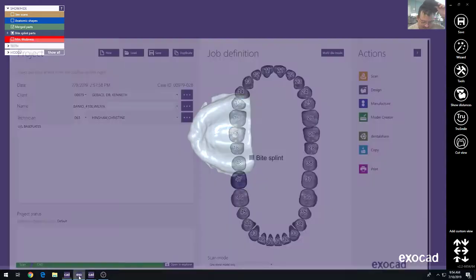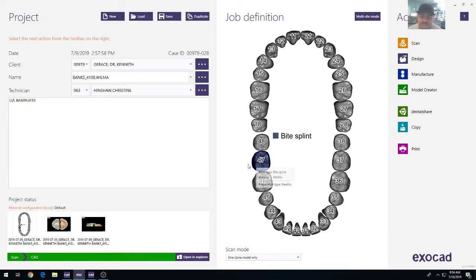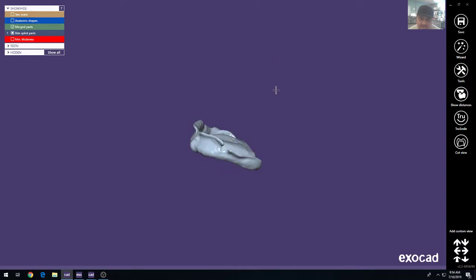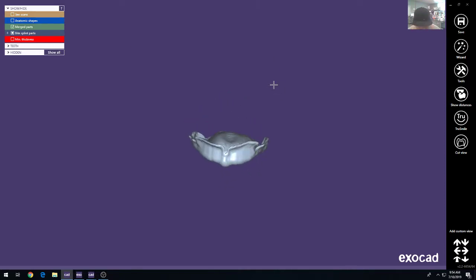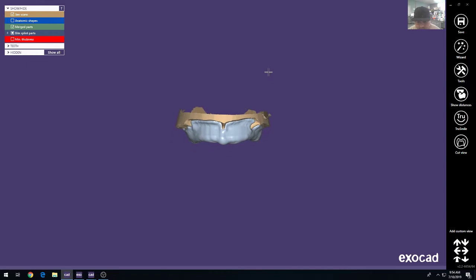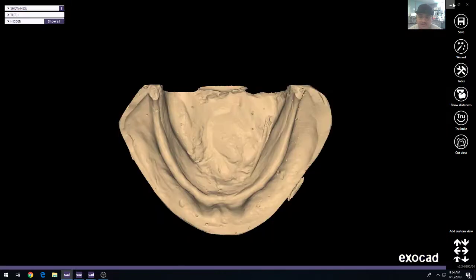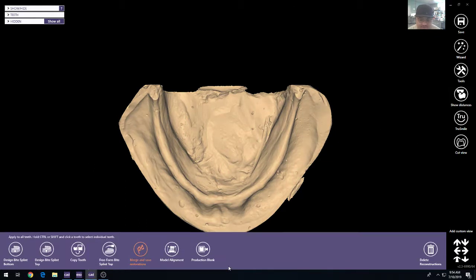You can see that we mark basically the database for one tooth Bitesplint. That will activate everything you need. Unfortunately, you're going to need to do the upper and lower in separate workflows in separate work orders.